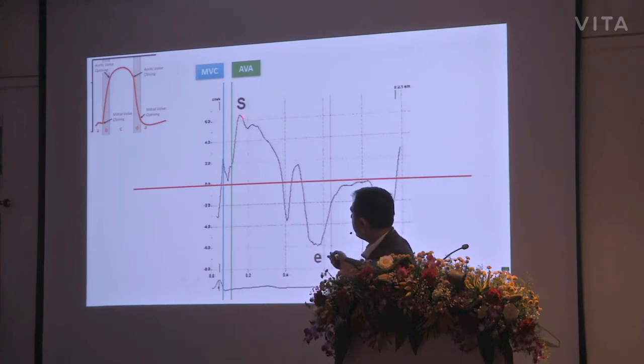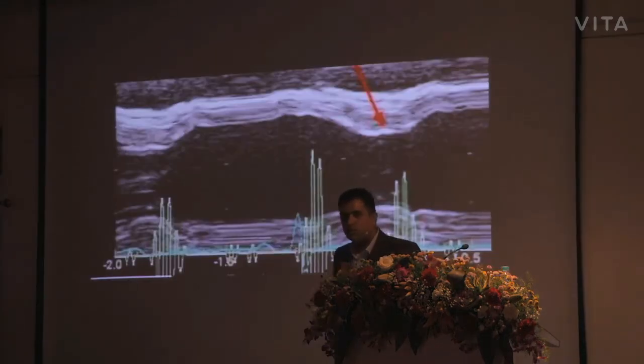As you can see, just like in our pressure tracing, you have a very sharp initial uptake of the curve, which corresponds to the forceful ejection of blood, and which slowly tapers down and it crosses the negative. So the next question that people were asked is, where is the aortic valve closing? And well, everybody thought the aortic valve closes there. That is a point where the curve slowly goes into negative. However, that wasn't true. Okay.